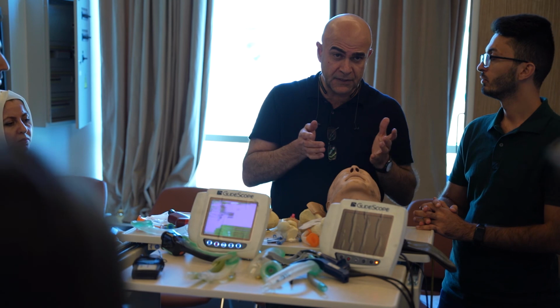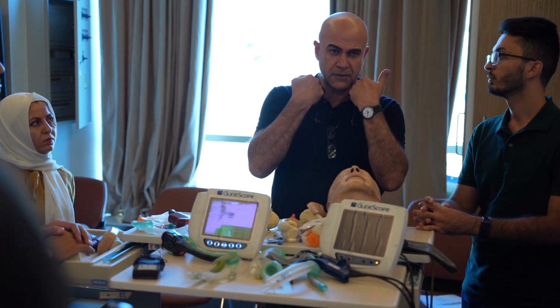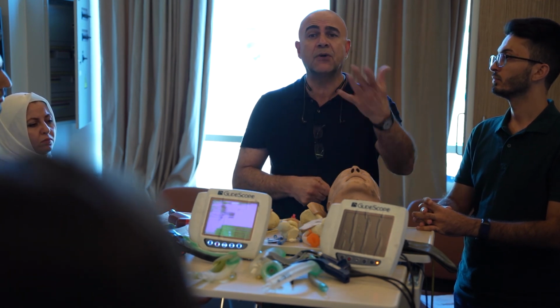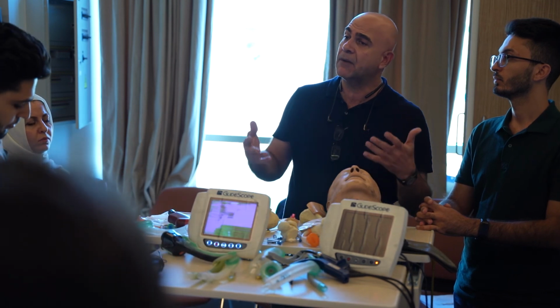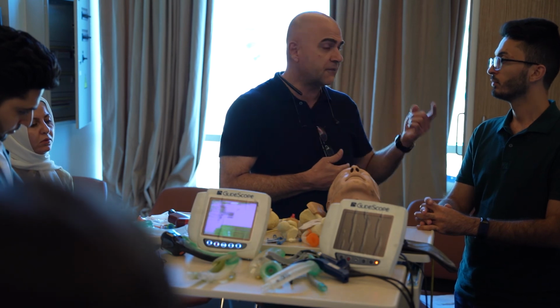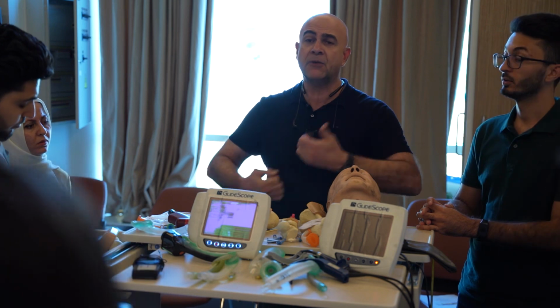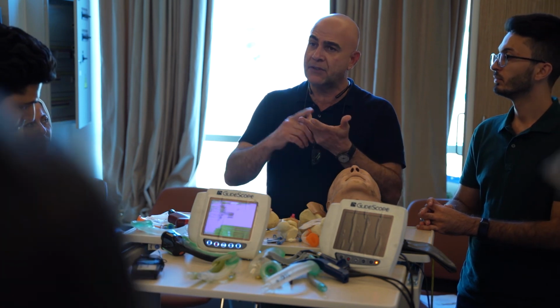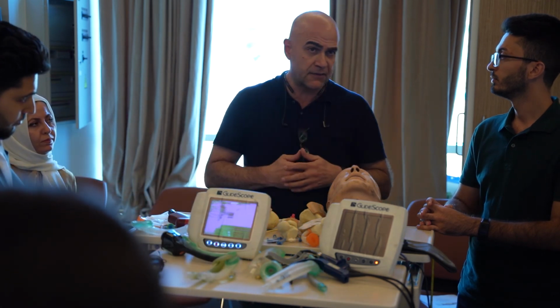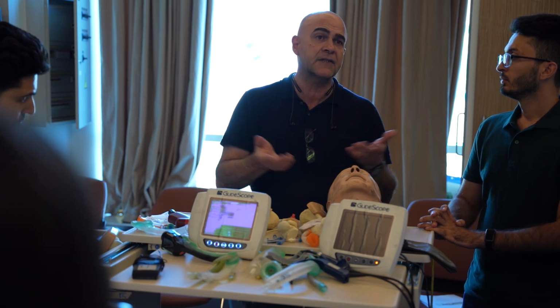If present, it means the patient cannot tolerate an oropharyngeal airway. So you are going to use a nasopharyngeal airway, excellent, and put oxygen. After that, if you are satisfied with the airway, I'm going to check the breathing. What is the first thing you are going to ask in the breathing? Respiratory rate. And you expose to inspect for any deformity, chest elevation, any cyanosis, any signs of obstruction. And you will do palpation, percussion, and auscultation.